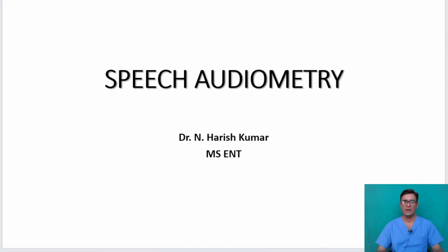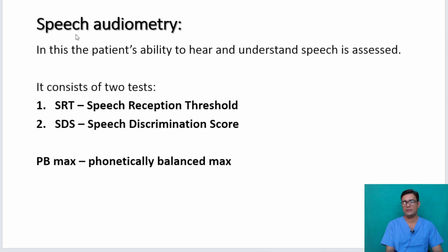Hi everyone. Let's talk about speech audiometry today. Okay. So speech audiometry. Speech audiometry is the patient's ability to hear and understand speech.